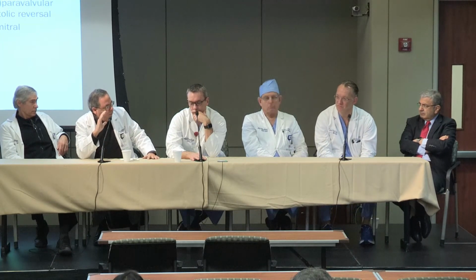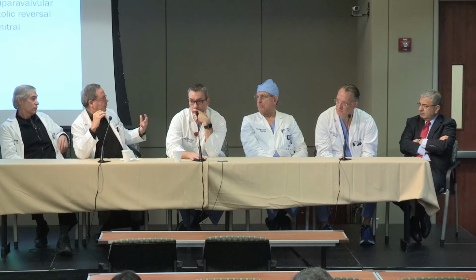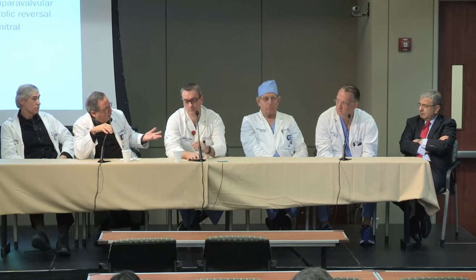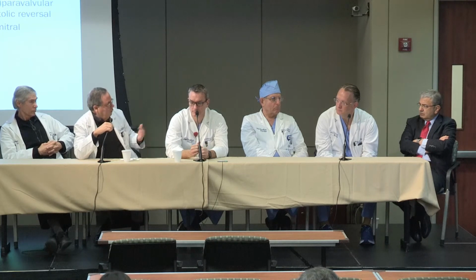Before we get to that, first of all, I think these are beautiful pictures, and in our setting here, I think this was very much the way to go in terms of getting the full picture. But our trainees may go out and practice in other places where they may not have access to the refined cardiac MRI that we have here. So one question I want to ask Colin is, with the information that was provided with the TEE, would you have felt clinically, from the point of view of all the experience, that this paravalvular leak was already quite significant, and the decision-making would probably be similar with or without the MRI?